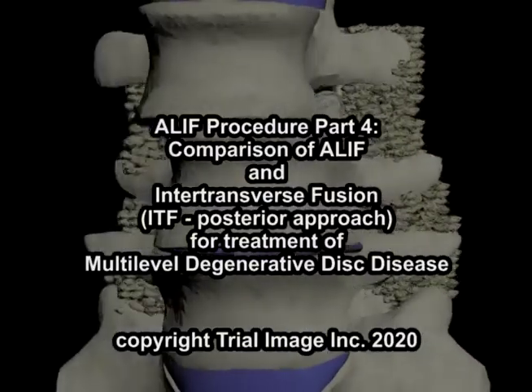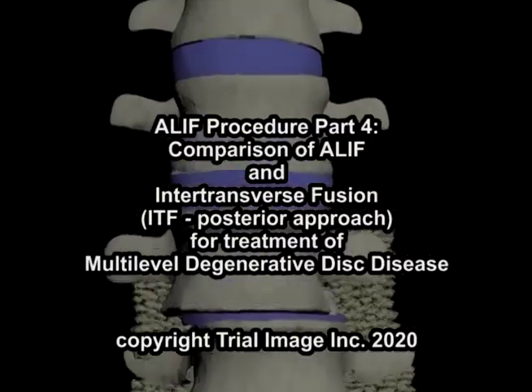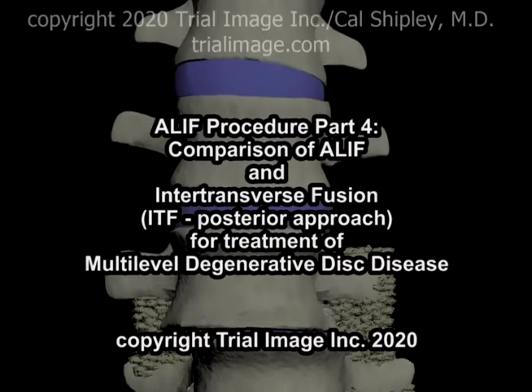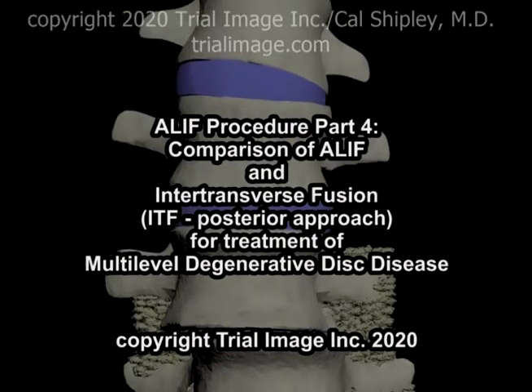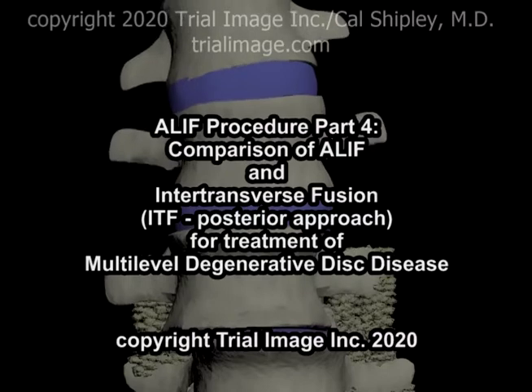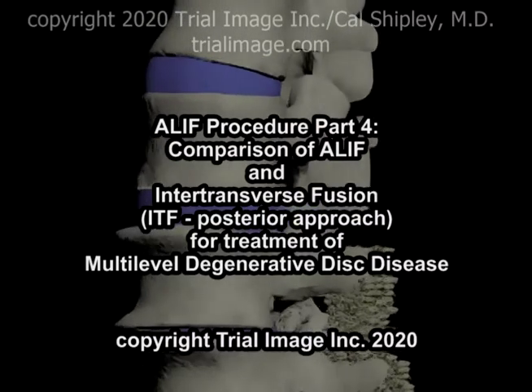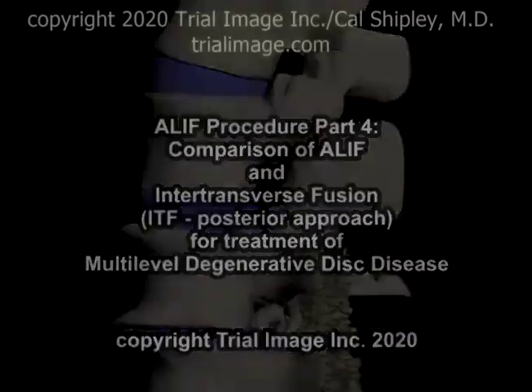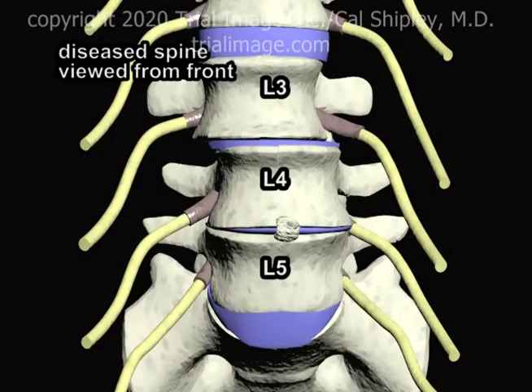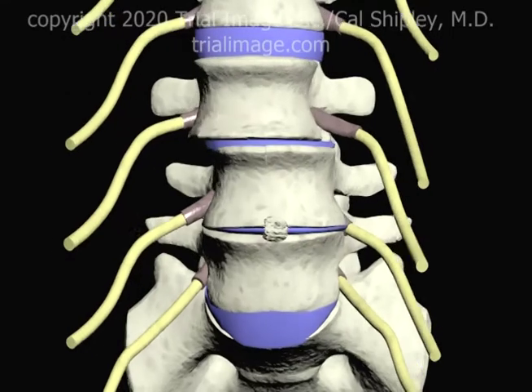This is Dr. Cal Shipley presenting a comparison of the ALIF anterior lumbar interbody fusion procedure and intertransverse fusion for the treatment of multilevel degenerative disc disease. For this presentation, I'm going to be using the same spinal model as in Parts 1 and 3 of my ALIF review.